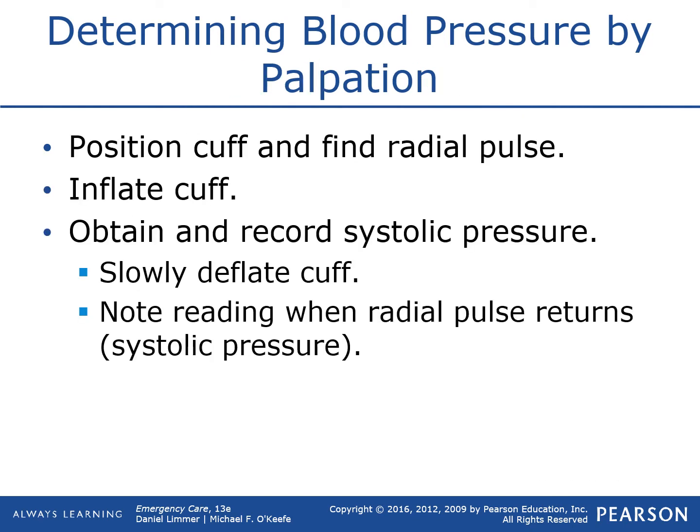Our preferred way of measuring blood pressure is by auscultation, so that's listening. It's using the stethoscope and listening for those beats. There are instances where you can't hear those beats. That could be because the patient has too much fatty tissue. It could be a noisy environment and you can't do anything to get out of that noisy environment. Or it could just be your stethoscope can't hear that well. So in the event that you can't auscultate a blood pressure, we can palpate, which means feel a blood pressure.